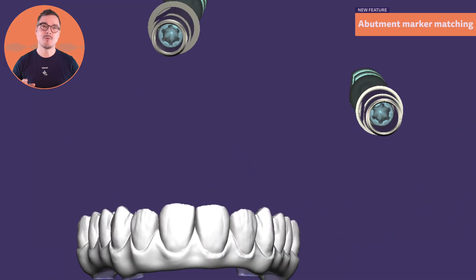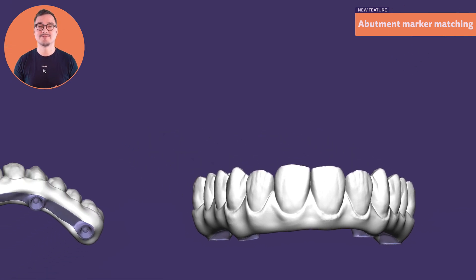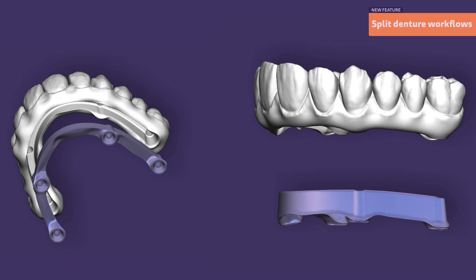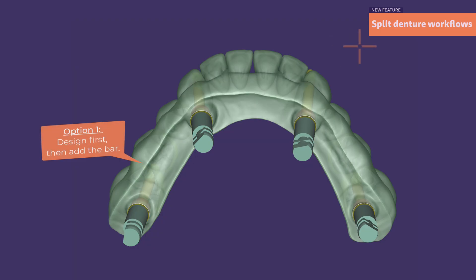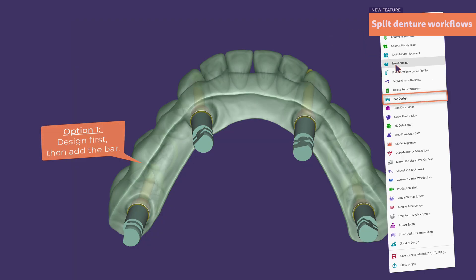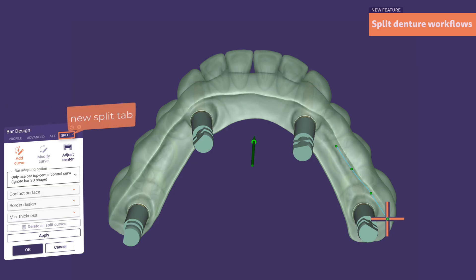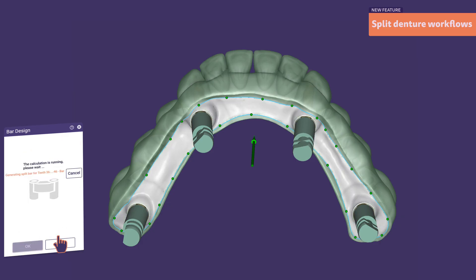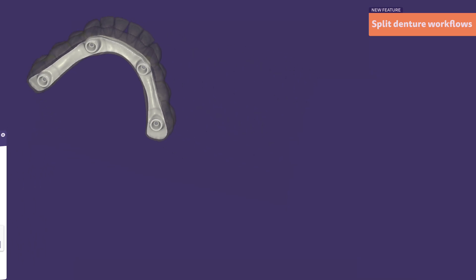Splitting complex implant restorations into two parts is no longer just a wish. You choose the workflow that suits your needs best. Once you're done designing the anatomy and gingiva as usual, you can start the bar design in expert mode, where you have access to the new split tab. Draw the split curve as desired and hit apply — DentalCAD now performs the file split for you, no additional steps needed.